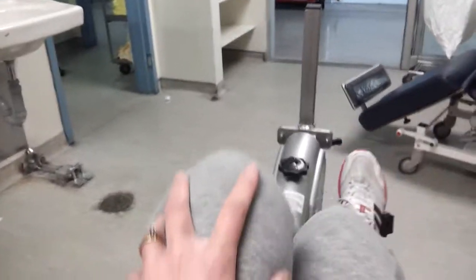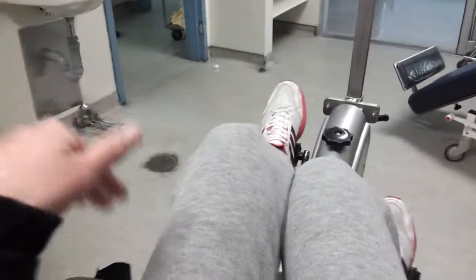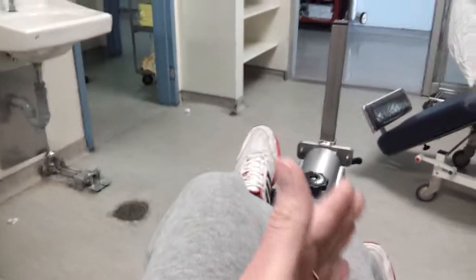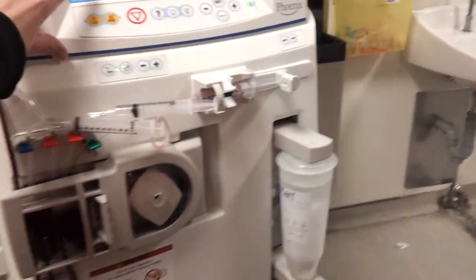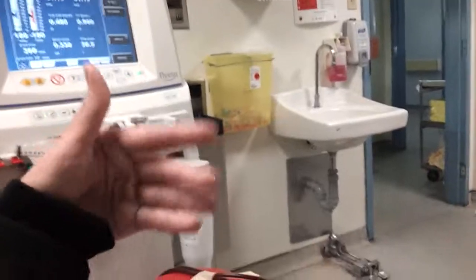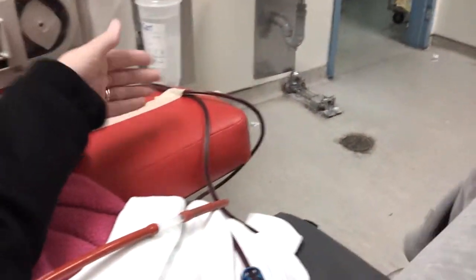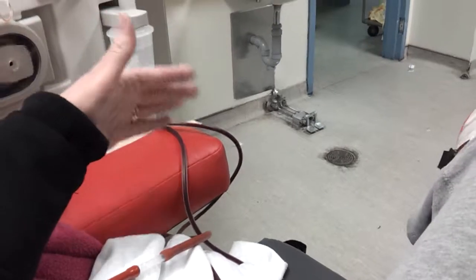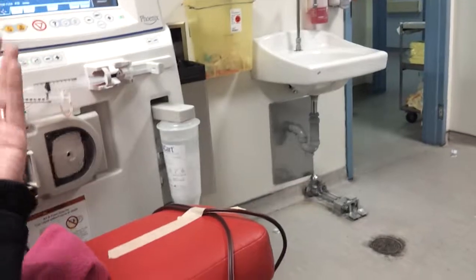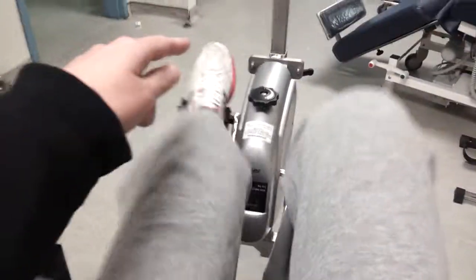Okay, so the reason why being on a bike is so beneficial is because, well, many reasons. The first really important thing, though, is that this pump here on the machine pumps this much blood. Blood flow right now is about 410 mils a minute, okay? Which is great, because the faster the blood pumps, the more blood's going to be cleaned through my body. So that means that I'll have better clearances, I'll feel better, and I'll have somewhat good kidney function, which will keep me alive longer.